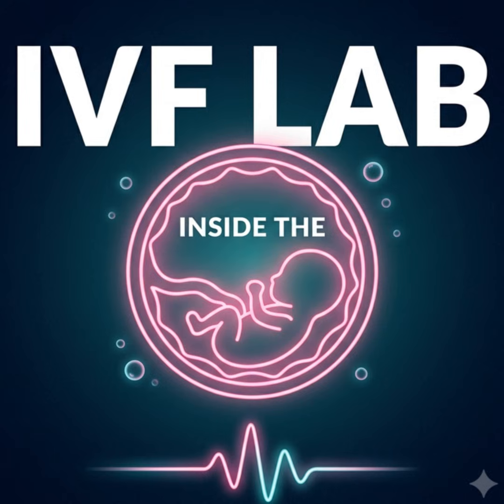Because of the massive risk of recrystallization. Recrystallization. Okay. When we vitrified the oocyte, we moved it so violently fast that the water molecules couldn't form ice. But as we warm the cell up, as the temperature rises and the solid glass matrix begins to transition back into a fluid state, those trapped water molecules suddenly regain their kinetic mobility. Right, they start moving again. And if the embryologist warms the cell too slowly, those water molecules will instantly find each other, organize their hydrogen bonds, and form destructive microcrystals of ice right there in the warming dish.